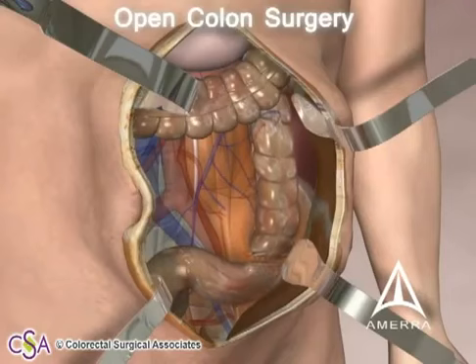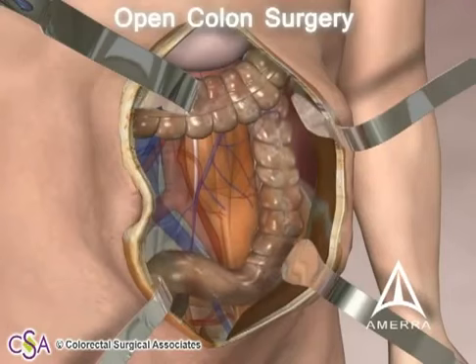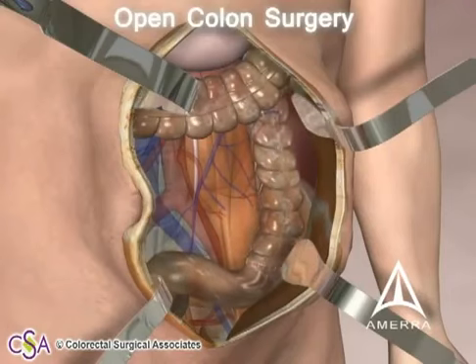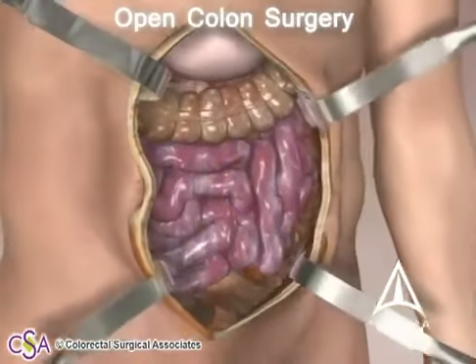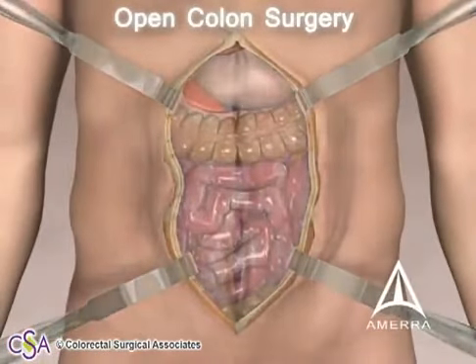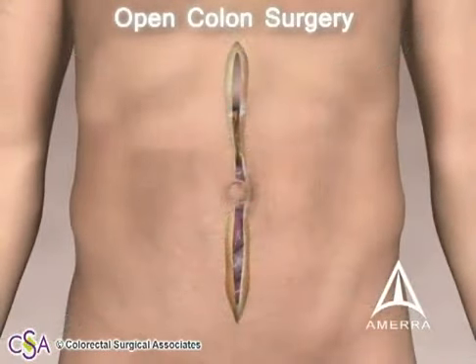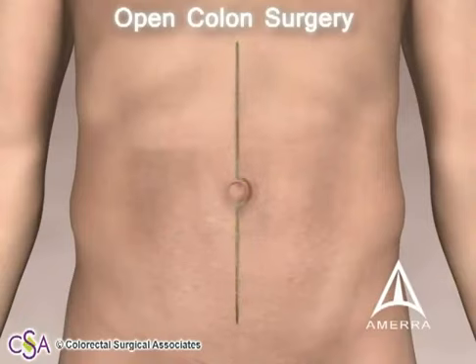A surgical anastomosis is then performed by joining the two ends of the colon together. Retractors are removed and the abdominal wall is closed. The incision is then approximated with multiple sutures or staples.